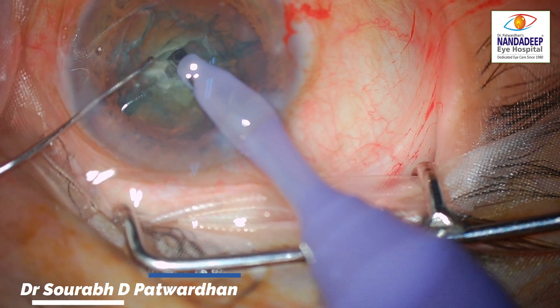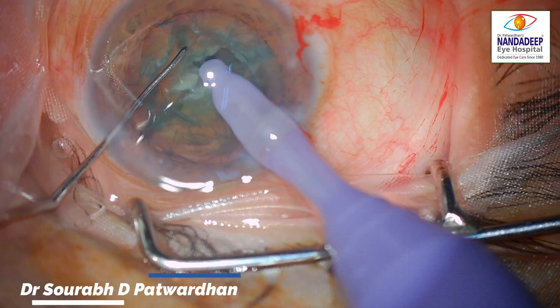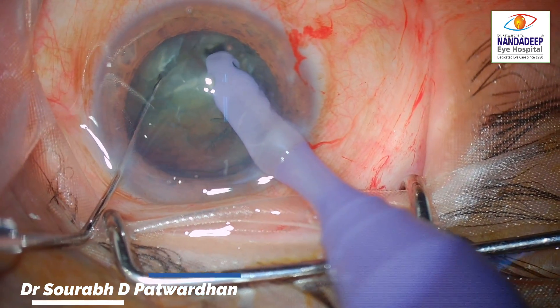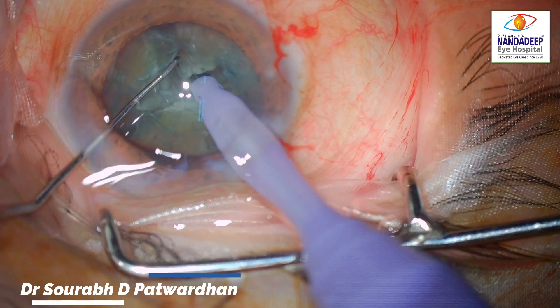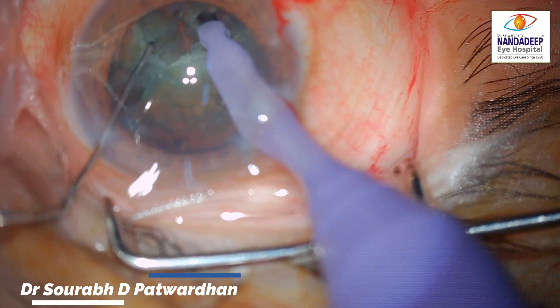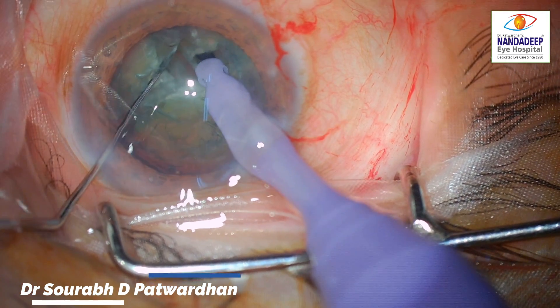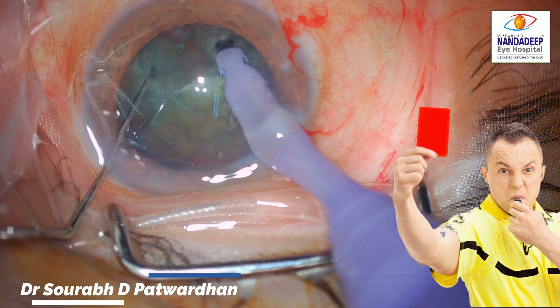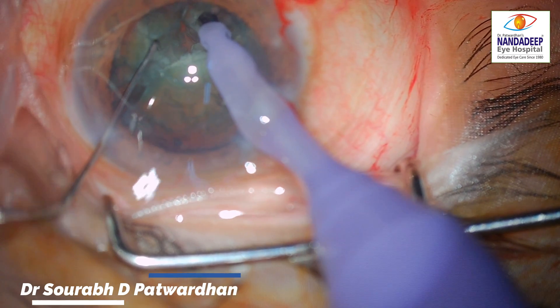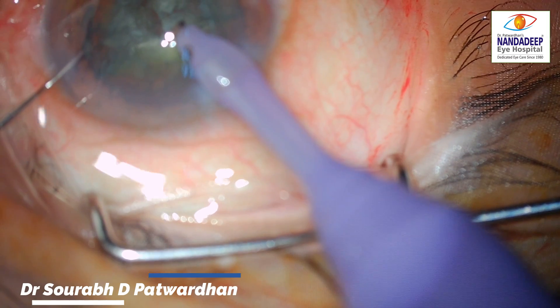Now look at this — he tries to divide but the division is not complete, and he still misses it, trying to chop another piece. Watch this: he is pushing the nucleus away when the feco tip is to be buried, taking the support of zonules and posterior capsule. This has to be absolutely avoided when doing chop, because you are unnecessarily putting pressure on the zonules and may cause zonular dialysis.